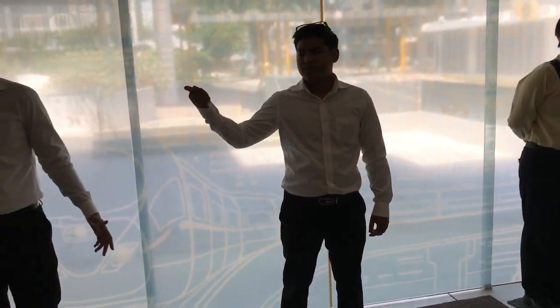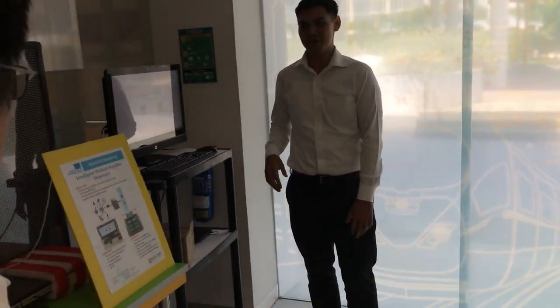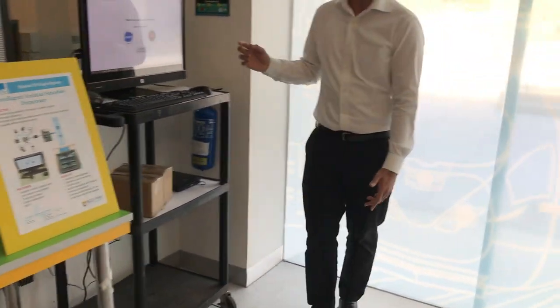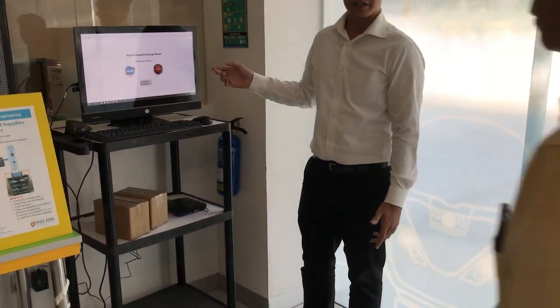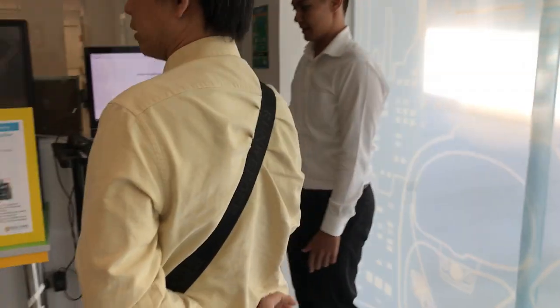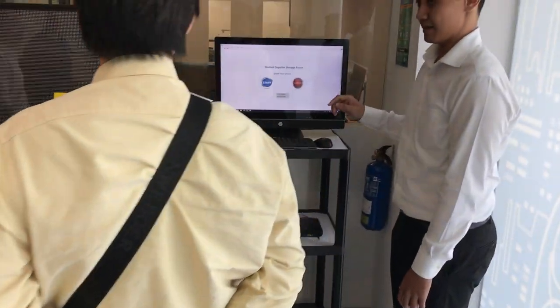Now I will be explaining the PC that is to be placed on the storage room to get access to the storage room.